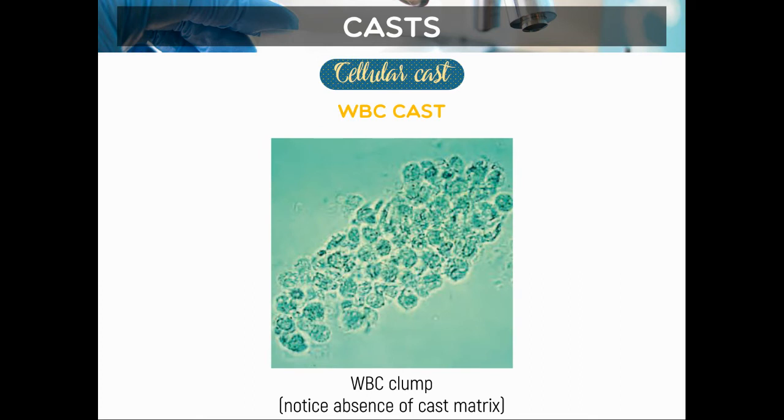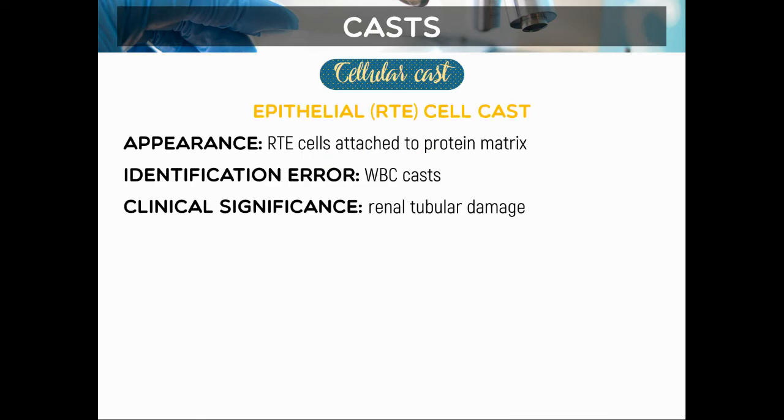So again, pyelonephritis is increased WBCs, increased bacteria, and increased WBC cast, while cystitis is increased WBCs and increased number of bacteria. So, that's what I will add for WBC cast.